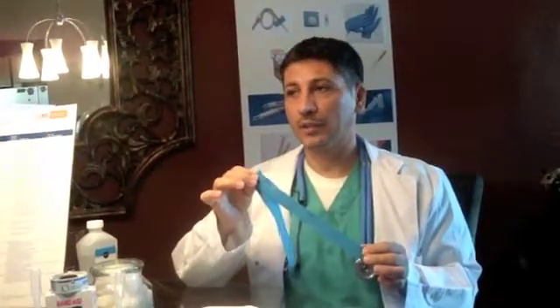Select the appropriate vein for venipuncture. The larger median cubital, basilic, and cephalic veins are most frequently used, but others may be necessary and will become more prominent if the patient clenches his fist tightly. Apply the tourniquet 3 to 4 inches above the collection site. Never leave the tourniquet on for over a minute. If a tourniquet is used for preliminary vein selection, release it and reapply after 2 minutes. Clean the puncture area with a 70% alcohol pad. Wait for the skin to dry and do not touch it after cleaning.